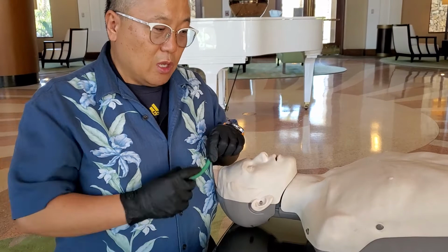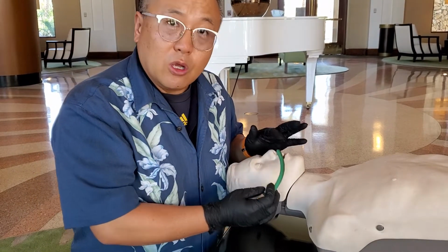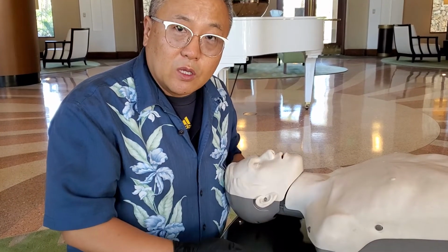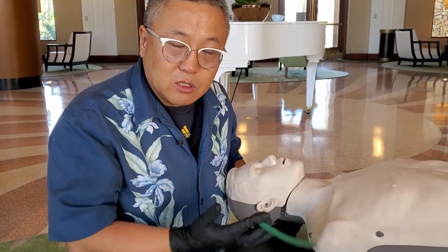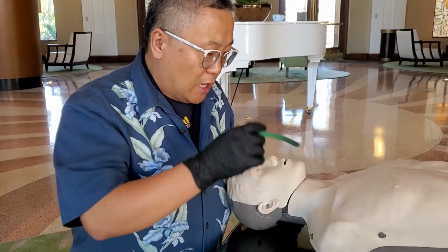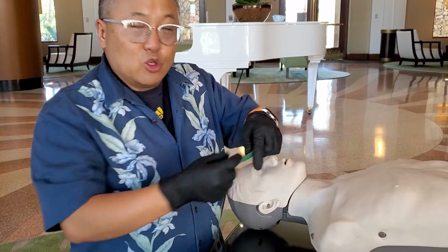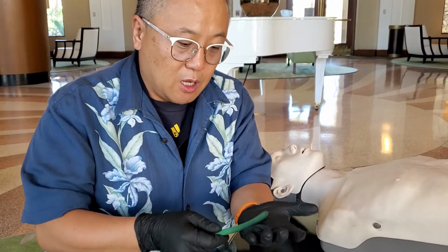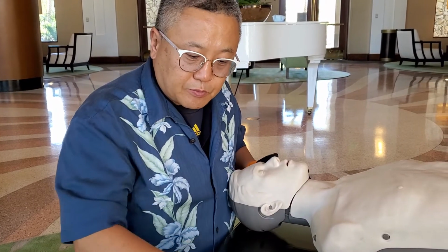Please remember, always asked on the EMT paramedic test: how do you measure, what's the contraindication of the NPA, and what is the indication of the NPA. The patient can be conscious or unconscious, you can use it. And how to measure, you look at the tip of the nose, and always use a water-soluble lubricant, and then put it in the nose, okay?